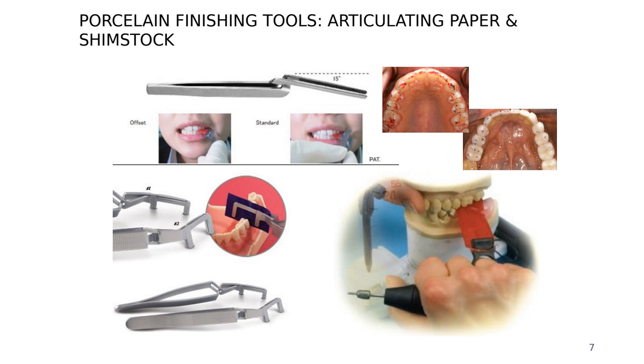What happens if we do a crown and we adjust the occlusal just by the vertical dimension, just by the patient biting up and down? I mean, you want to account for the lateral movement. Yeah, but what happens if we don't do that?